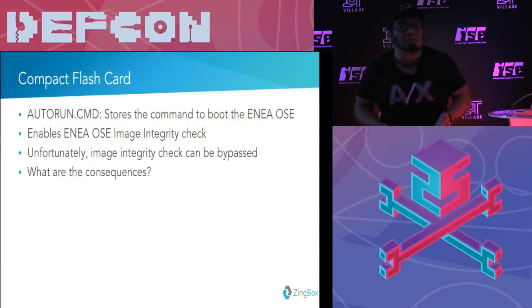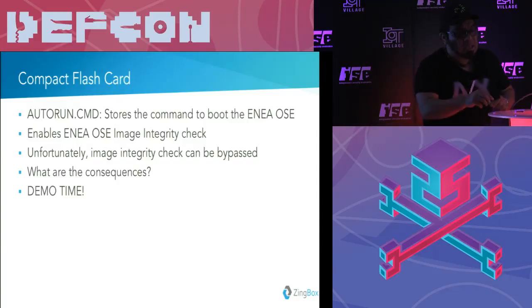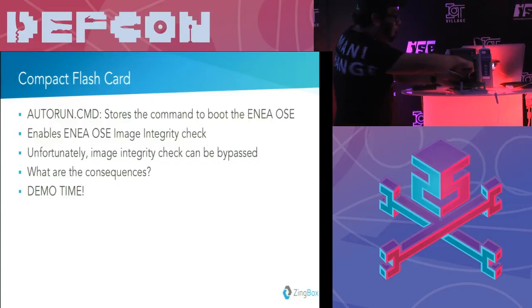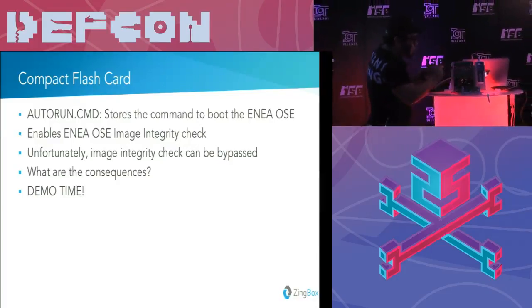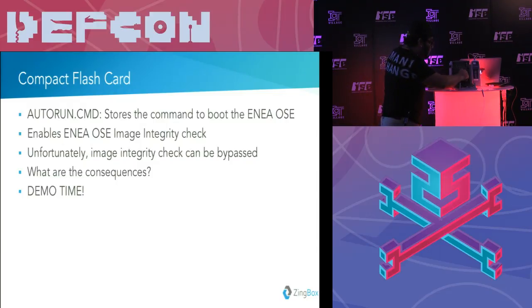What are the consequences of that? I prepared a quick demo so that you can see how it works. What I'm going to do is switch this. This is the original compact flash card, and I'm going to switch it with this one. This one comes with the bypass of that real-time operating system. It comes with some modifications. Let's see what those modifications are and what the consequence would be.